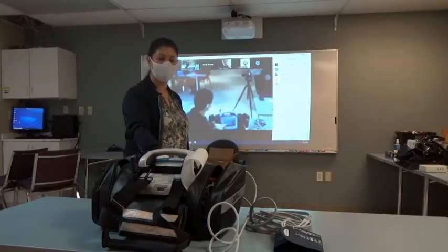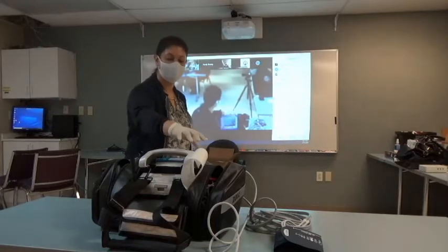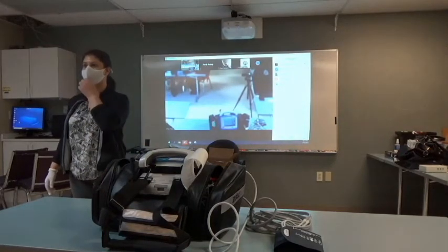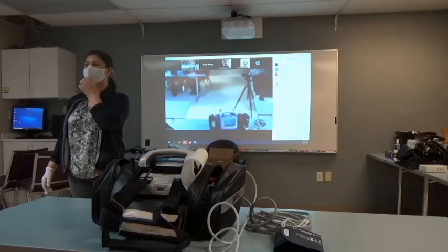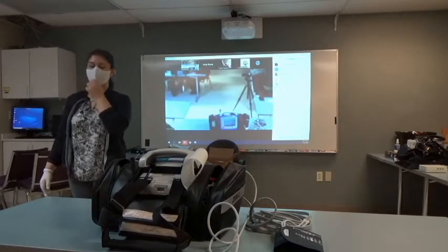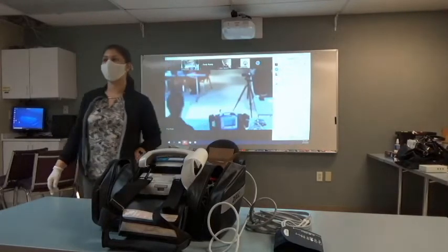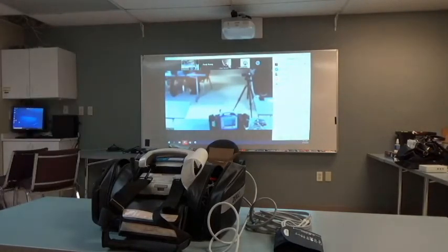The first page of your book is your interpretive statement. The purple arrow flips the page of the book. If you press it once, you're going to get your ST values and your axis deviations. If you press it one more time, you're going to get a side-by-side view of the 12 lead you just took and the 12 lead continuing in real time.